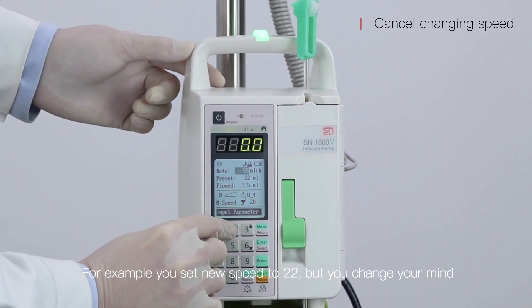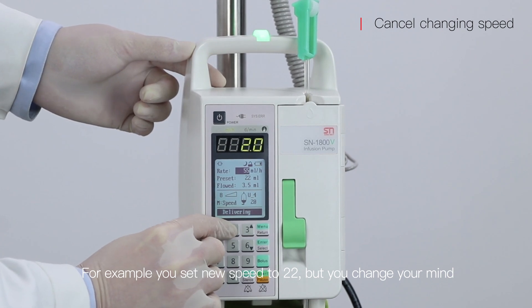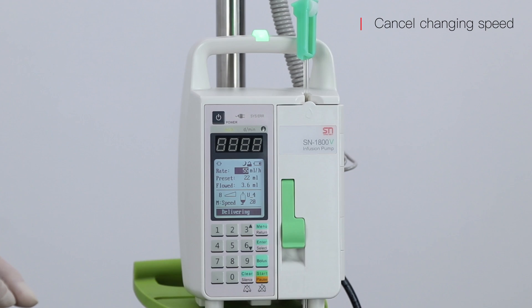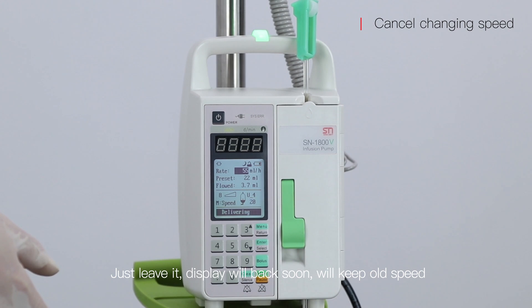For example, if you set a new speed to 22 but change your mind, just leave it. The display will return soon and will keep the old speed.